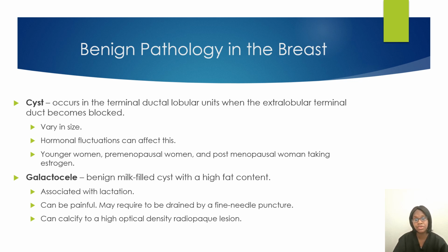It can be painful. If it is painful and bothering a patient and keeping them up at night, then the radiologist is going to recommend a fine needle procedure where they aspirate it. A needle will go inside the breast tissue with a syringe hooked to it, and you will just aspirate the cyst or drain it.